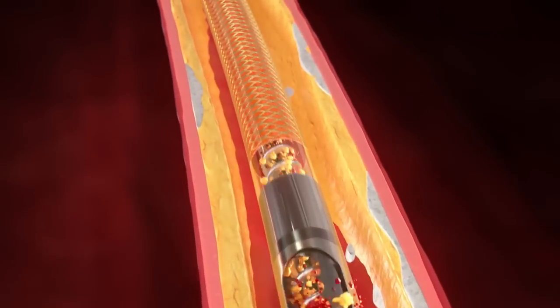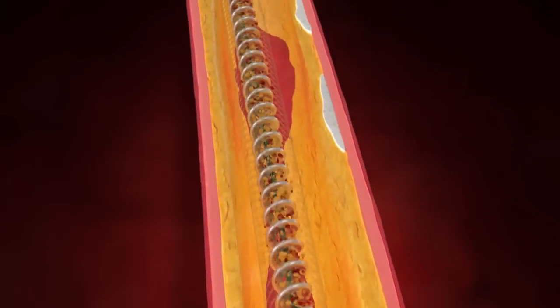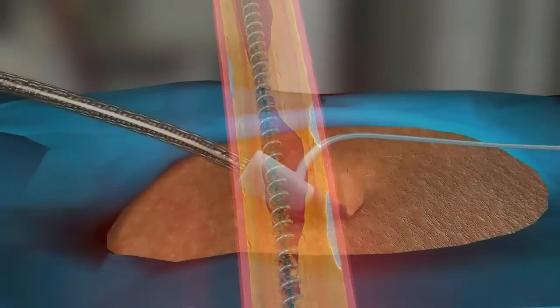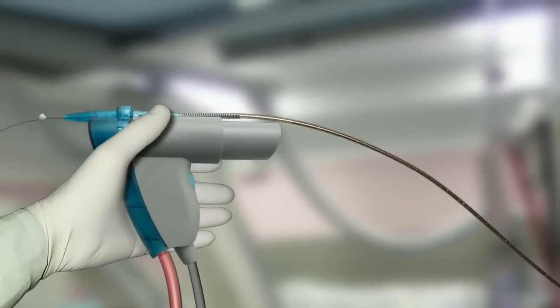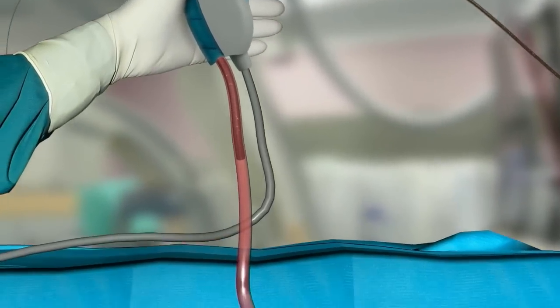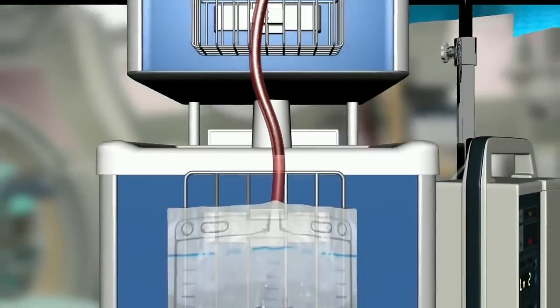All of this is driven by a precisely machined internal helix that runs the length of the catheter. From tip to collecting bag, the Rotarex atherectomy system modifies, excises, and aspirates plaque and thrombus from the peripheral arterial lesions and occlusions.